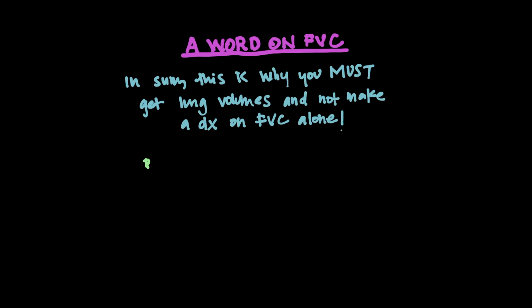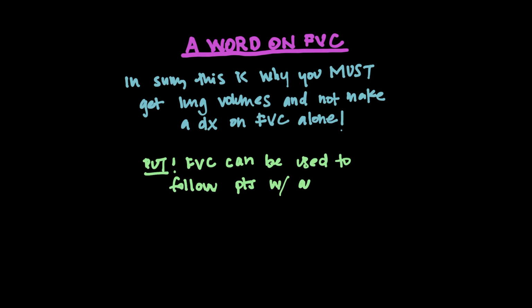But I will say, once you have made the diagnosis, you can use the FVC on follow-up clinic visits to follow your patient's progression, because it's just a lot easier to measure spirometry than getting in a volume box.